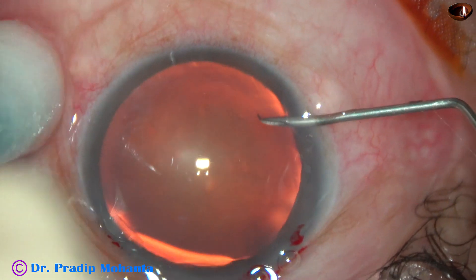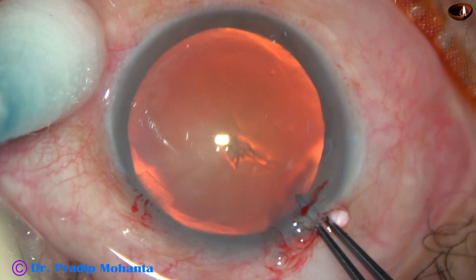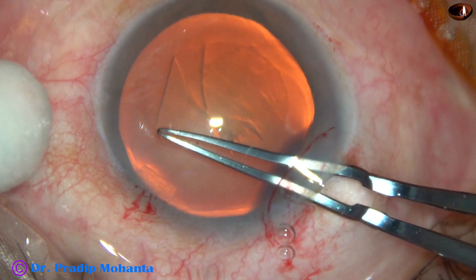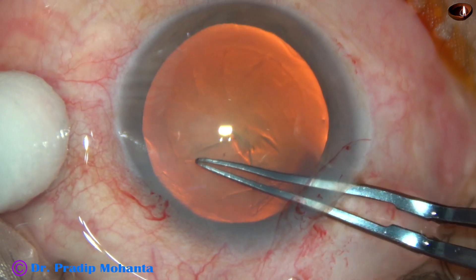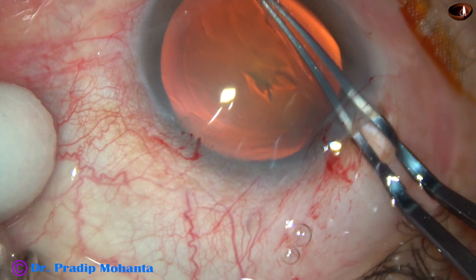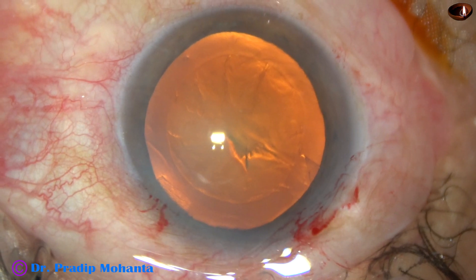Now this is capsulorhexis. The anterior capsule has been incised and the capsular tag has been raised by a needle. I hold this capsular tag with the utrata forceps, give an upward thrust on the anterior lip of the main wound and complete the rhexis. This is a fairly round rhexis — you can call this manual femto.